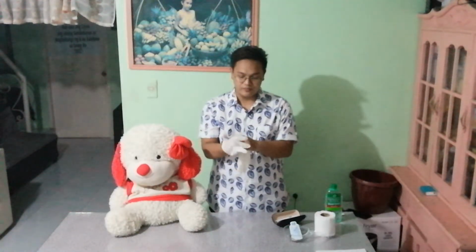So let us proceed to assessing the rectal temperature. For our first step, we need to place the bed at an appropriate working height, and we need to put on non-sterile gloves. Let's assume that we have already adjusted the bed to an appropriate height. Next thing to do is we need to put on non-sterile gloves.